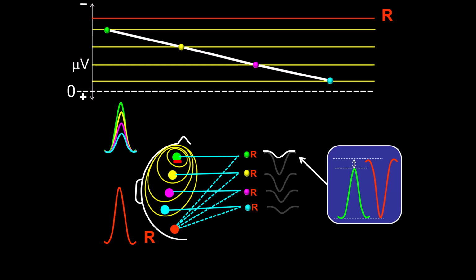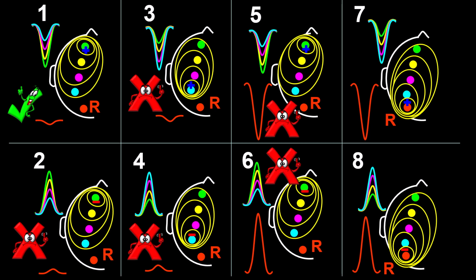By doing the same operation as we have done previously, you can see that the resulting wave from the first derivation is smaller than the one in question from the same derivation, and that the following waves using the same process are bigger and not smaller as the ones in question. This process continues, and the further you go from the source, the bigger the wave will become, and this can clearly be noticed in the fourth derivation. So option 6 is also not a sound option.